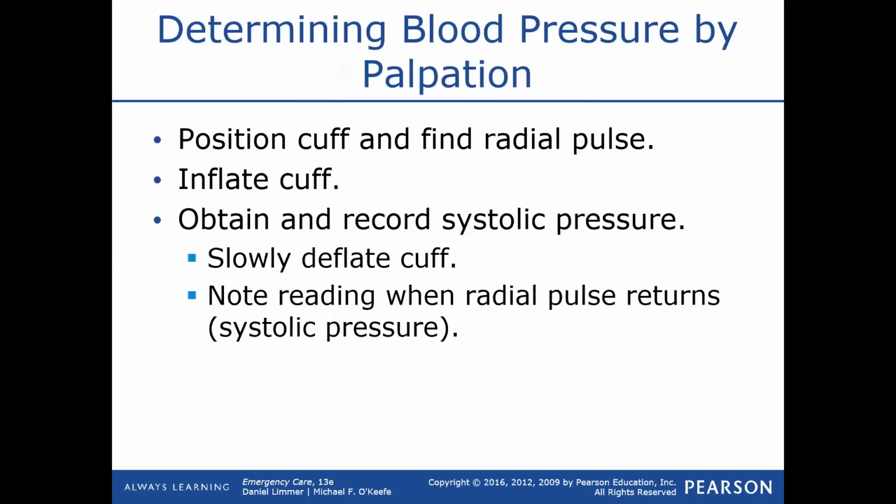And then record your measurements. Usually what I do is I write them on my glove. Some people like that, some people don't. Some people like to have a little notebook. I find it easy to just write on the back of my non-dominant hand, and a time. You want to write the time you took the vital signs as well.